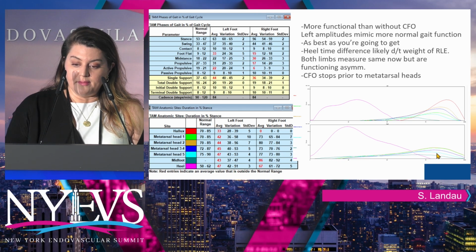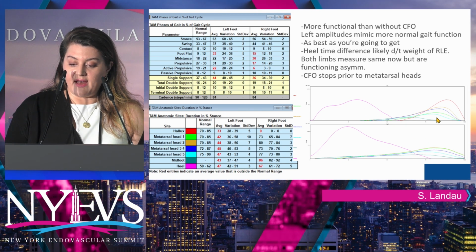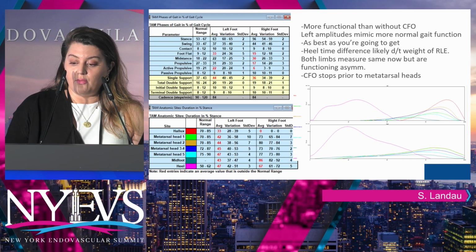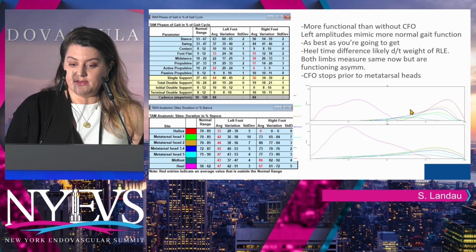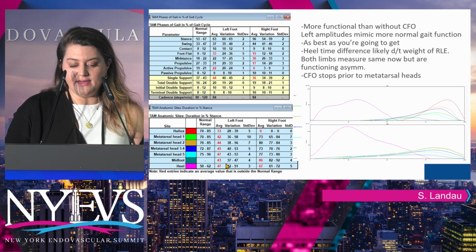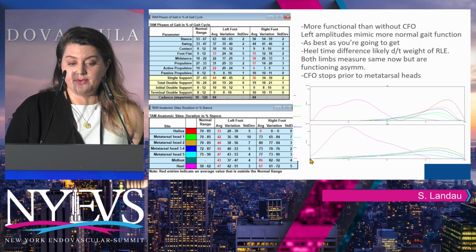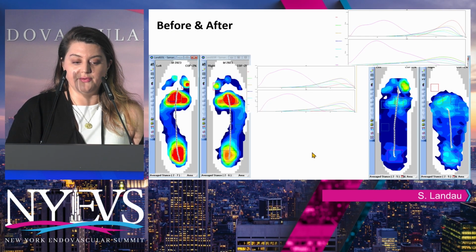I didn't have any waveforms there. And then my left side, which had my orthotic and the leveler, was the best, and I had a good double humped camel, as you would call it. But I couldn't get the heel time more narrow than that, and I attributed that likely to the weight of the cam boot.